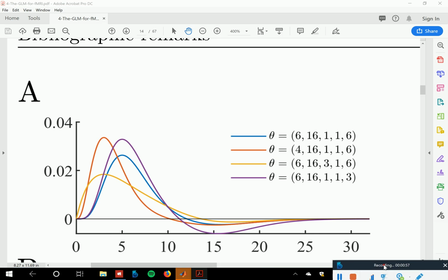There we go. So once you know all of this, once you know what a convolution is, you know what this means, which we now discussed, you know that's an H, you know what the hemodynamic response function is, then in principle you can go and simulate the predictions based on your experimental paradigm. And I also strongly encourage you to do that before doing your GLM analysis, to actually have a look, especially if you're trying things like, for example, not using just stick functions, but boxcar functions, or parametric regressors, to have a look what this actually predicts in terms of your HRF in your regressor or your regressive function.